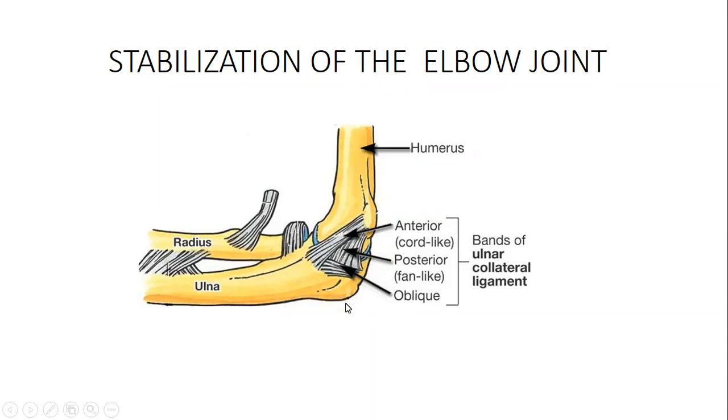While the lateral compartment tends to have its own complications, it has the common extensor tendon. So on the lateral portion, it's the common extensor tendon. The lateral portion of the elbow has to do with extension, while the medial portion has to do with flexion. This is very important and crucial when it comes to clinical assessment, because you are able to tell exactly which portion is involved.